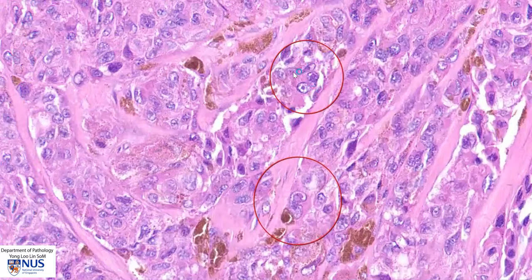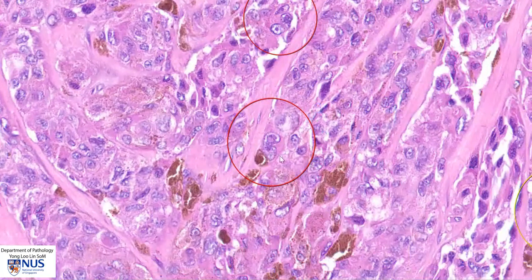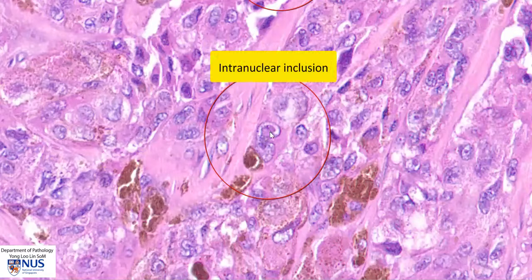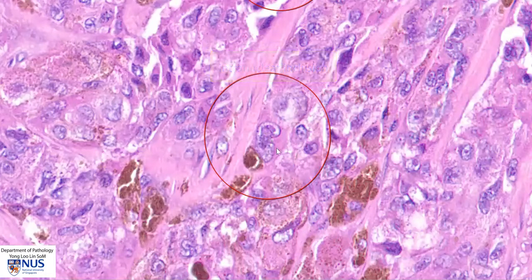Here is another example of a multi-nucleated tumor cell. And over here there is another feature commonly seen in melanomas: the presence of an intranuclear inclusion, which appears as a little island of cytoplasm within the nucleus. Intranuclear inclusions are quite frequently seen in melanoma.